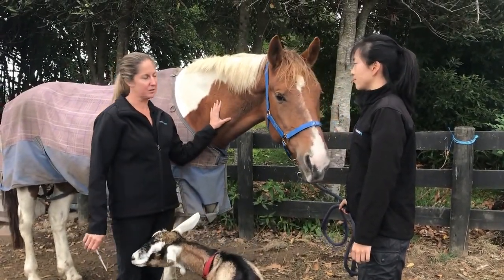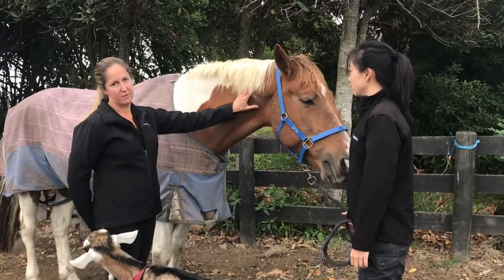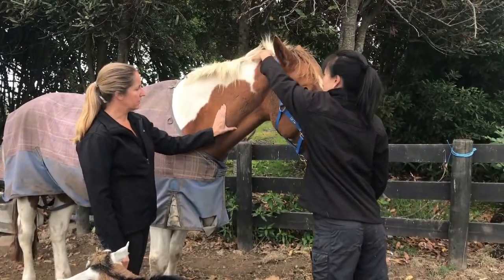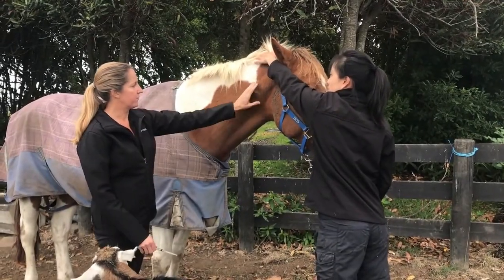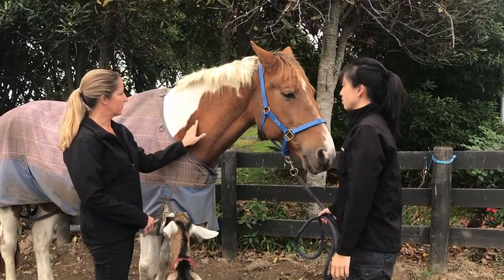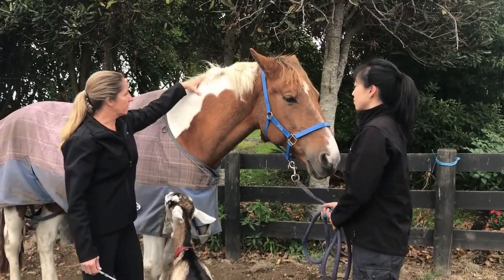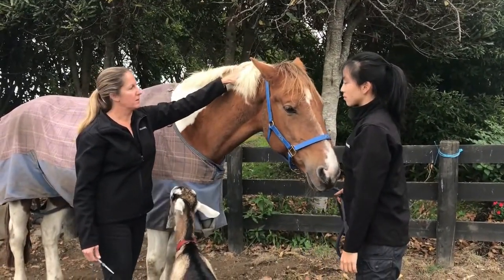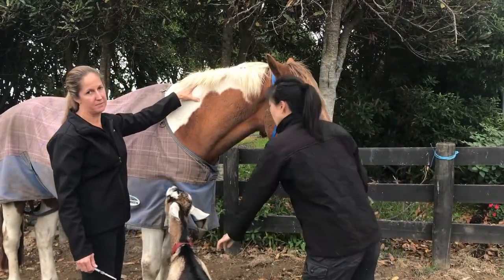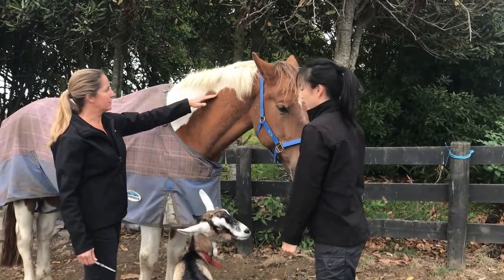In the neck, when giving an intramuscular injection, we want to go above the cervical spine. If you run your hands along the jugular groove, you want to go just above where you can feel the spine running right here. Along the top, we've got the ligament that holds their head up, called the nuchal ligament. Go about a hand's width down from the mane line, and then you want to go in front of the shoulder blade — so we've got a triangle here.